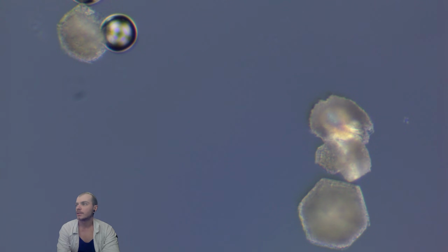It is interesting how soon it is forming its crystals. When it forms crystals, it means it is highly concentrated, I believe. So it is weird to see it so soon, and it can be the reason why they are dying or why they are not healthy.